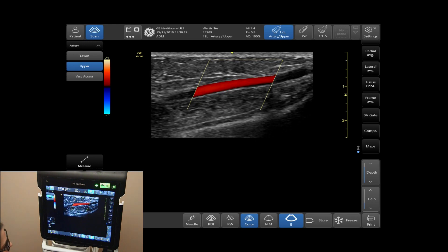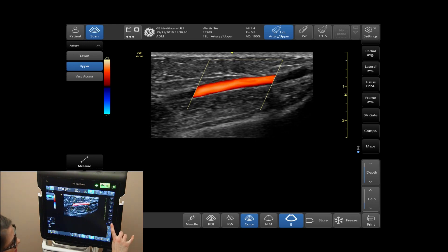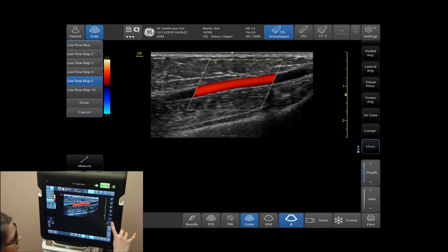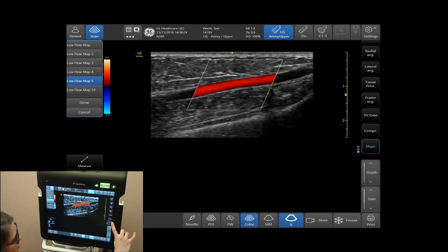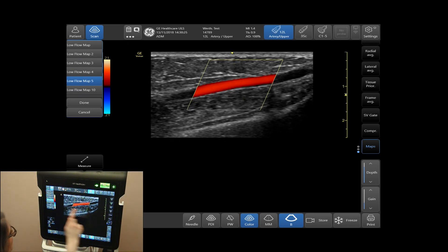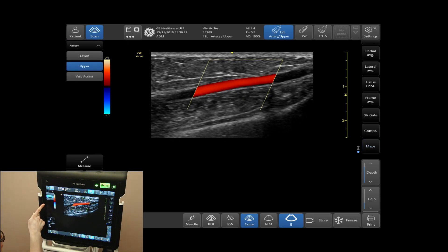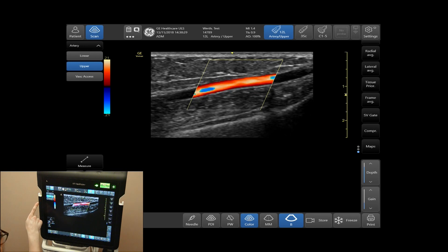To adjust the maps of the color, select Maps on the right side of your touch screen and this will allow you to adjust the way the colors are displayed.